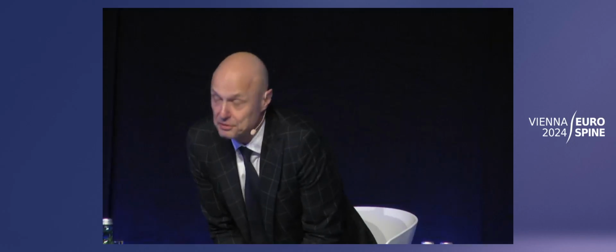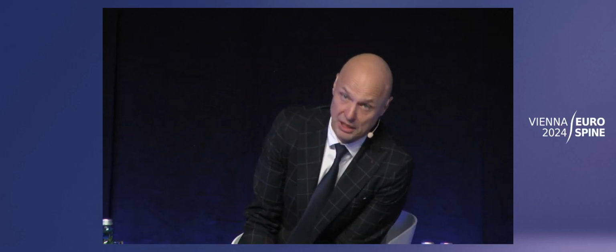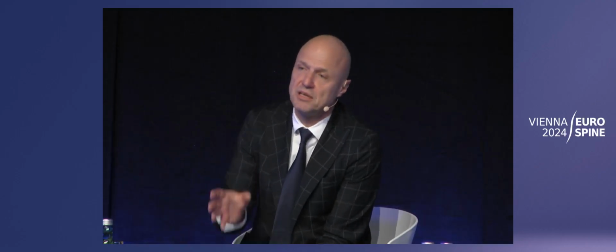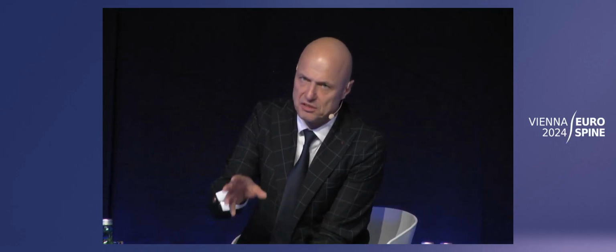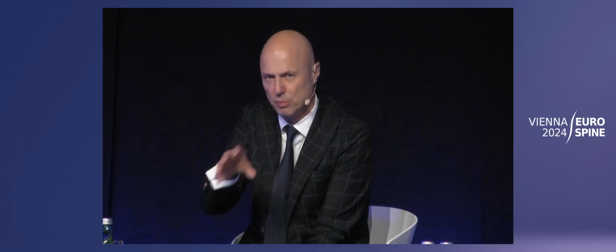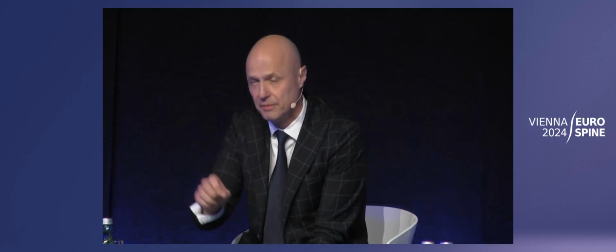That's a very interesting question. There are two things to say about that. CT technology is really advancing at the moment. We're getting photon counting CTs. With photon counting CTs, we can do material decomposition. There are already first papers out there looking at collagen content of the disc. So that will be an opportunity to look more in detail just using CT.